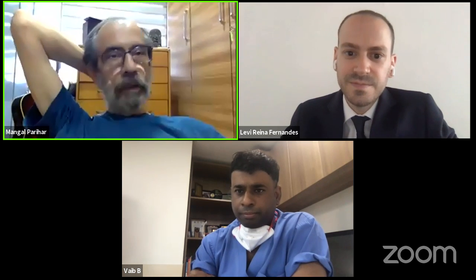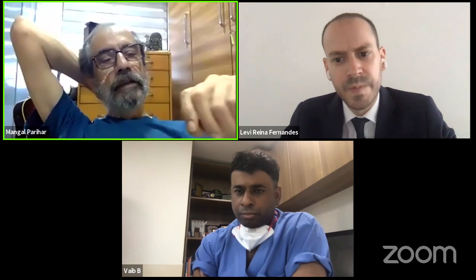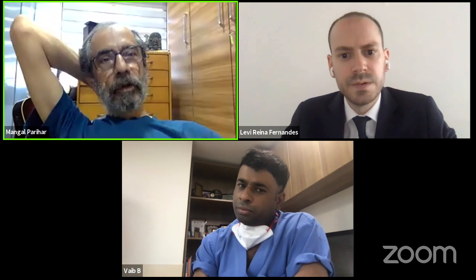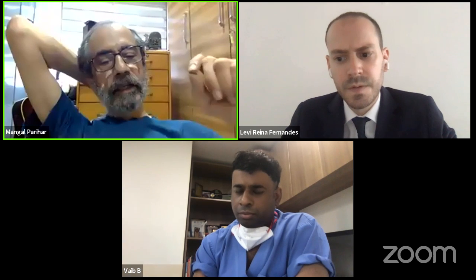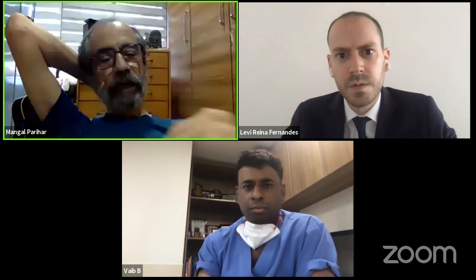No, of course. My question was exactly that, especially now that you have a good tool to measure the joint line, whatever you study out of this will be quite useful, in how many cases did the joint, what kind of plan?